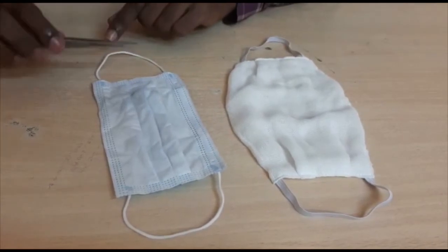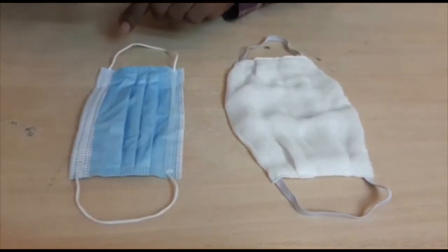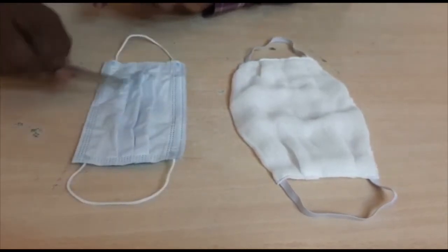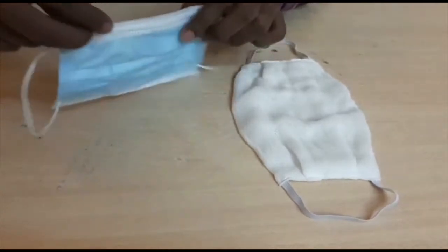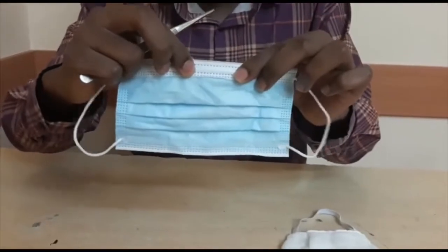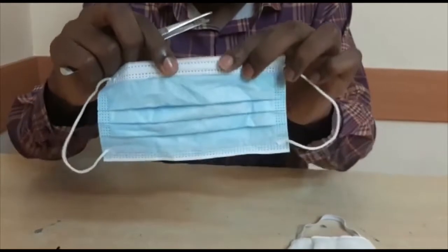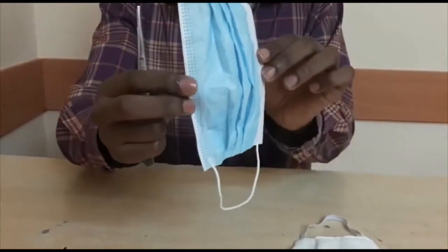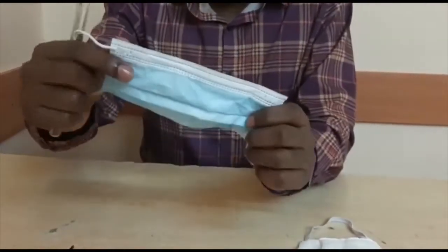The medical mask has different parts. There is a white part and a blue part. The white part must cover your face. The part which has the metal strip must cover around your nose, and the other end will cover your chin.